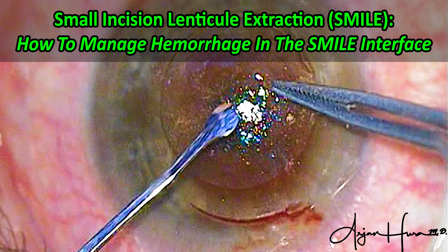How to manage hemorrhage in the SMILE interface. Use this simple tip to efficiently and effectively stop the bleeding and deliver a perfect visual outcome.